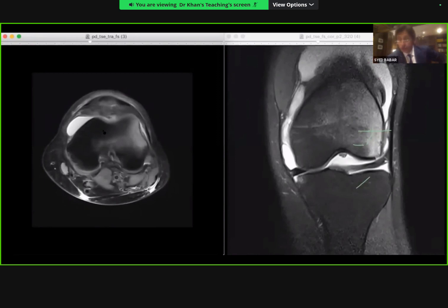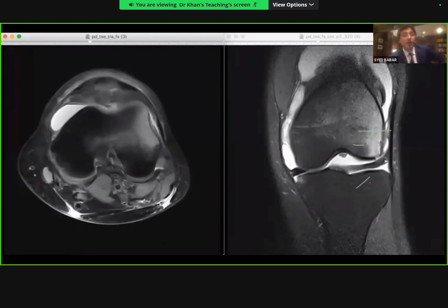So what do we do? We need to find where the fracture is. What would you do? Look at the T1s. Oh, sorry. Do a CT. Do a CT, absolutely. Simple answer. Even if you do a T1, you wouldn't be able to be absolutely 100% sure. Do a CT is the correct answer in the exam situation.